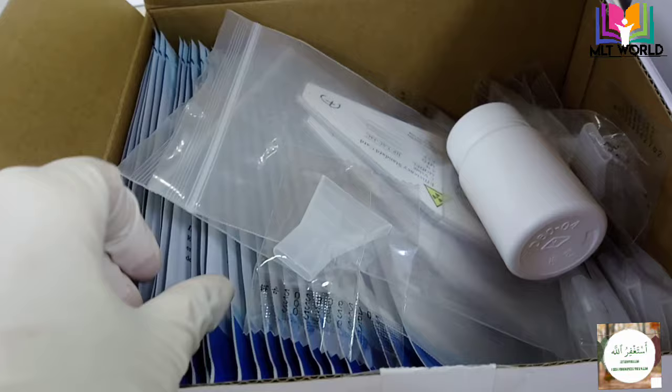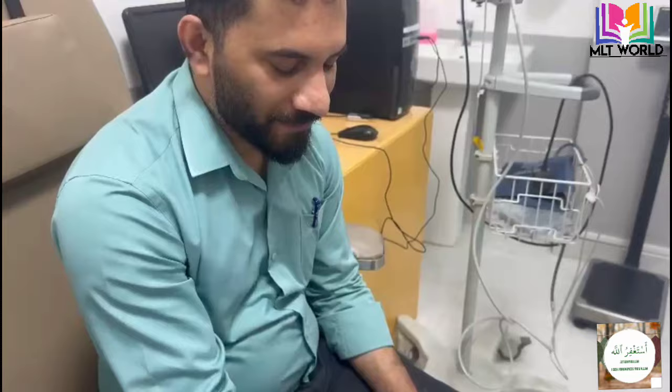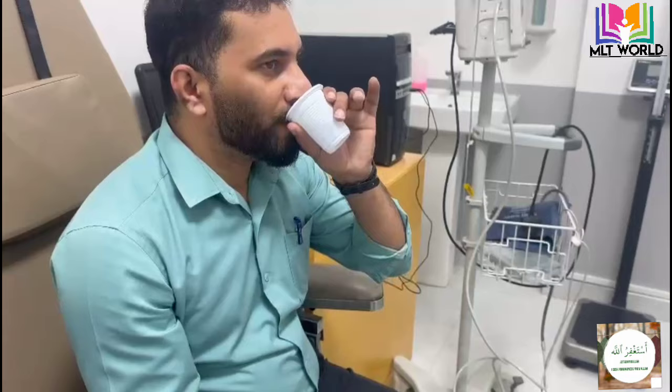So if H. pylori is present in the patient's stomach, the 14C will come out into the card through their breathing. Now the patient is ready — fasting is done. I have given the capsule with water and then we will wait for 15 minutes.